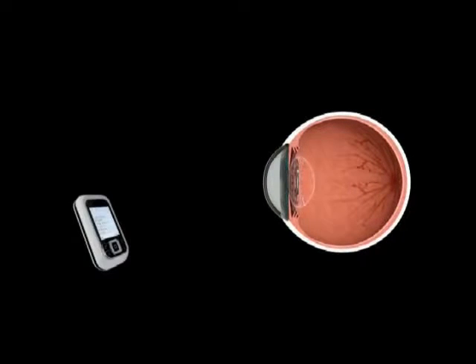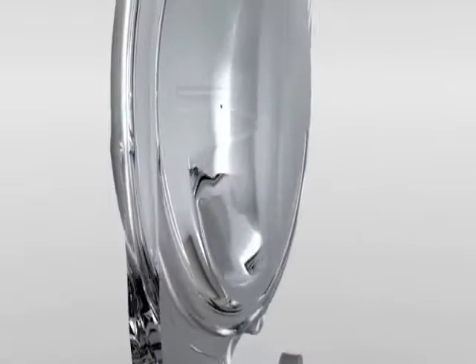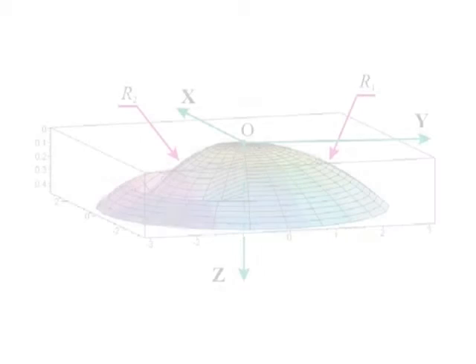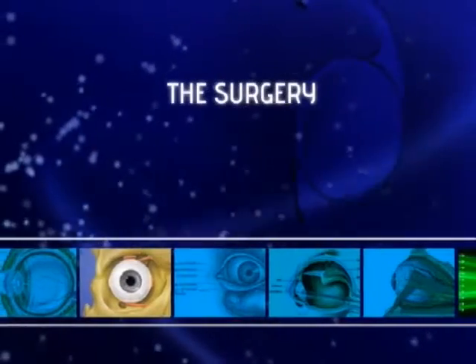These images for far and for near are clearly separated and will be exactly in line with each other, without image jump on the concentric optical zones produced by either refractive or diffractive rotational symmetrical intraocular lenses. Overlapping is thus reduced, and neuroadaptation will play a minor role in the performance of the lens.